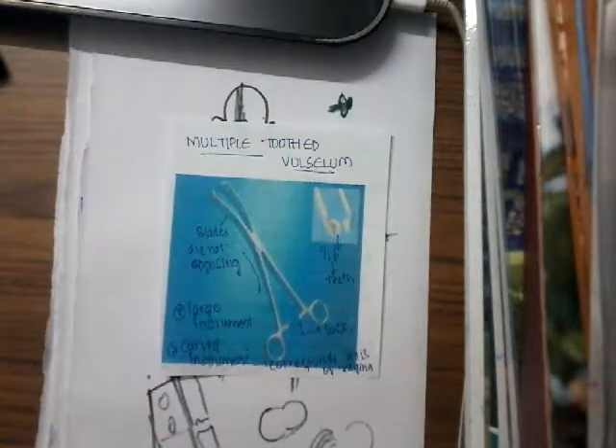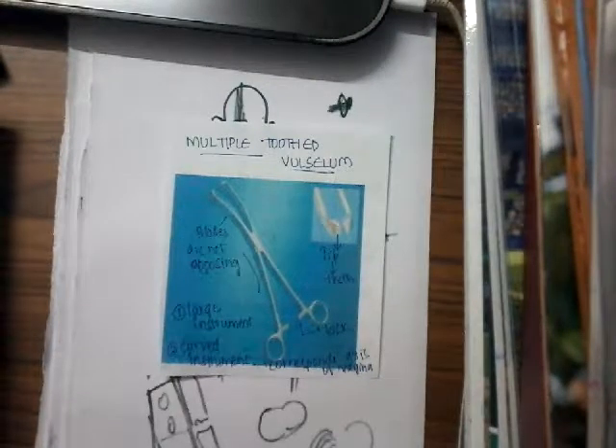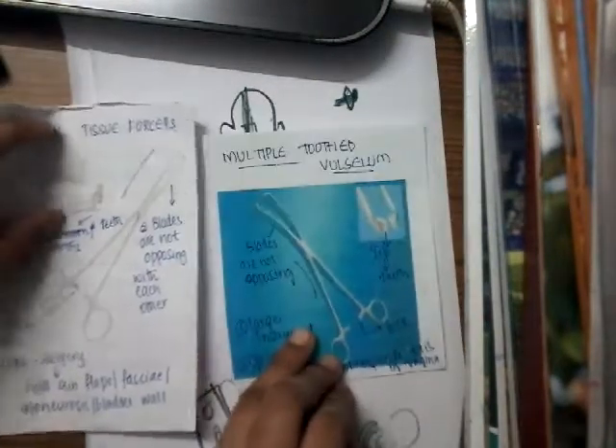Hello friends, welcome to a new lecture. Today I would like to explain about a new instrument called the multiple tooth valsellum. There is one more instrument similar to this one, which is called Alice forceps. Alice forceps is similar to the multiple tooth valsellum. Let me show you both of these and I'll tell you the differences.